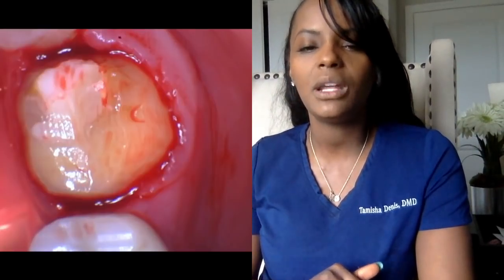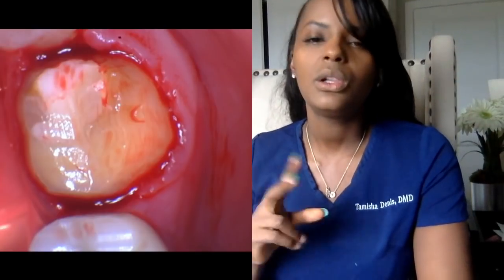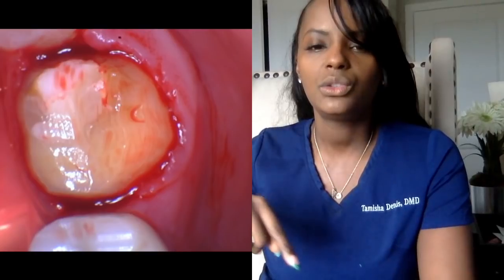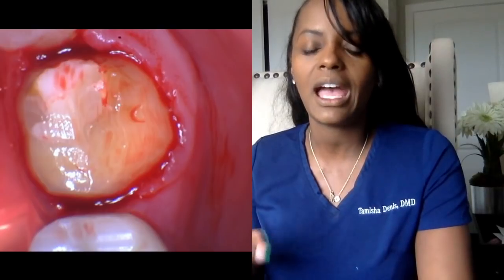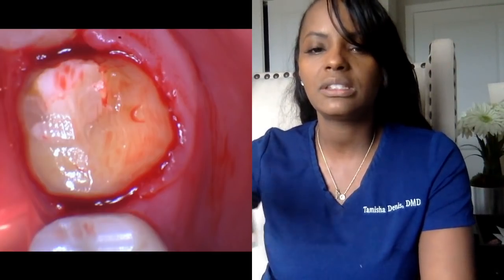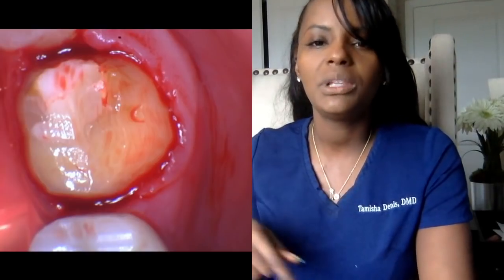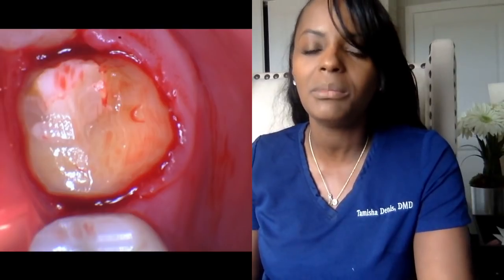After I numbed him, what we did next is we prepared the tooth by drilling around it. The closest shape I can think of is kind of like a square. You'll see the tooth prepared — drilled down. In his case, because I had just done a filling about a year ago, there was no cavity, the tooth was just broken. If he would have had a cavity, I would have done what we call a buildup, which means I fill the cavity underneath where we're going to do the crown. You can see it's drilled all around, and there's a little blood because in the process of drilling I touched the gums a little bit. He has no pain — he's completely numb, felt nothing at all.